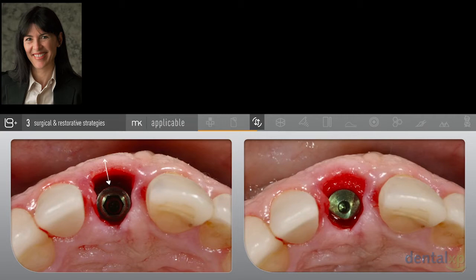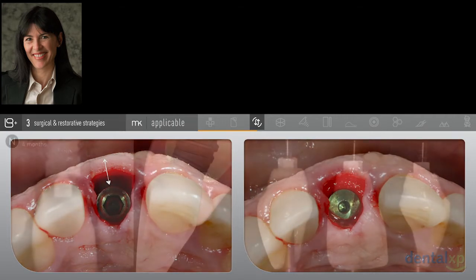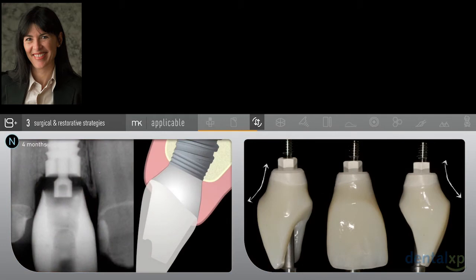So this is post-treatment. Now, my goal is to also, if I can, provisionalize my patient. In provisionalizing, whether it's one or multiple restorations we're placing, I'm looking very carefully at contours. So I may have taken a fixture-level impression, sent it off to the lab, or I may have fabricated something chair-side. But I have to look very carefully at the subgingival contours and create an environment where I can allow a robustness of the soft tissues, right? Because I think what we don't emphasize a lot is, we talk about how good bone is for long-term stability of tissues, but thick, solid soft tissues, in fact, are equally important to the tissue staying stable over time.